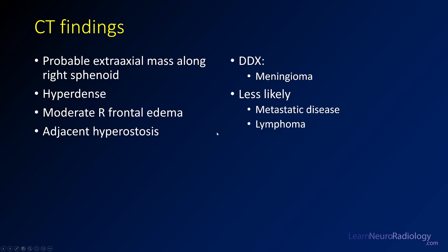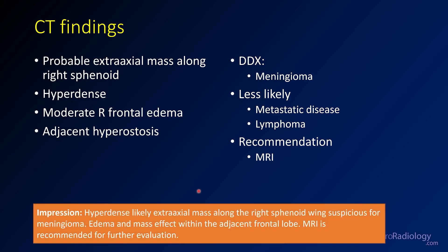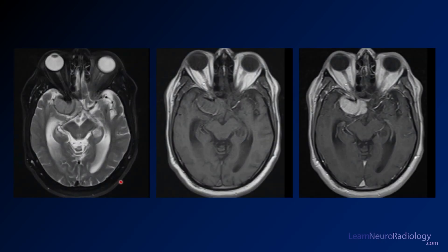Metastatic disease and lymphoma can definitely present as an extra-axial mass, but meningioma is most common. We want to recommend an MRI. In our impression, we see a hyperdense mass — likely extra-axial along the sphenoid wing, suspicious for meningioma. In this case I wouldn't even necessarily give a differential, but you can if you want. The edema and mass effect on the frontal lobe is noted, and we want to get an MRI of the brain with contrast.